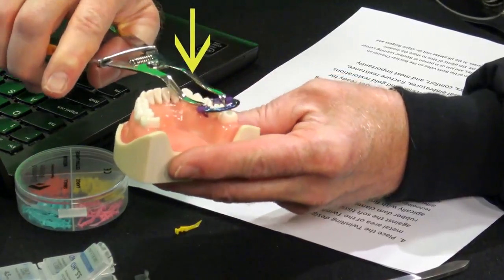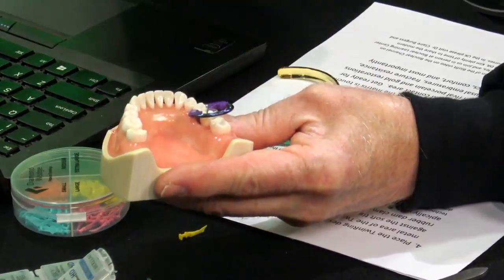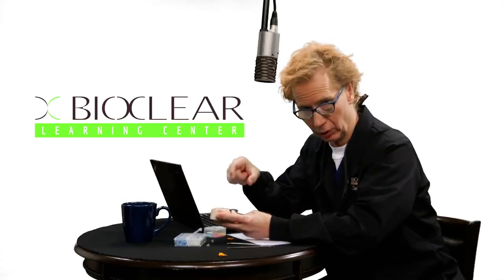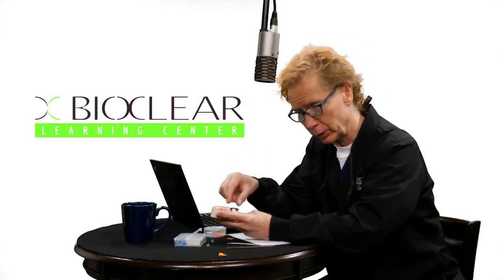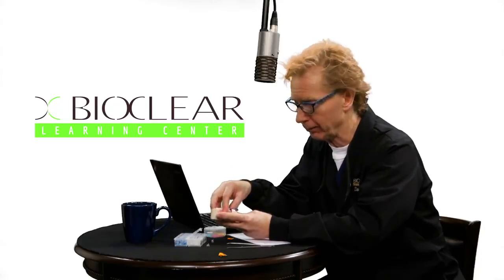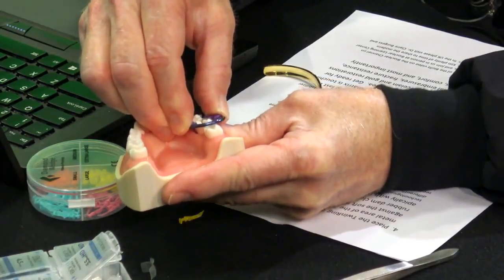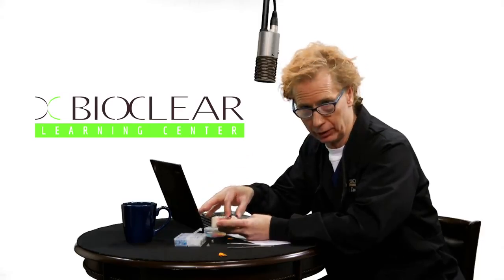I'm placing the separator fairly aggressively toward the gingiva. A lot of doctors do it the old-fashioned way and place it too high. Seat it gently against the gum tissue — for a patient who is not anesthetized, use gentle pressure to get pressure anesthesia; it should cause no discomfort. Then rock the separator back and forth to make sure it's seated fully apically. You'll have great retention of the twin ring against slip-off with this feature.